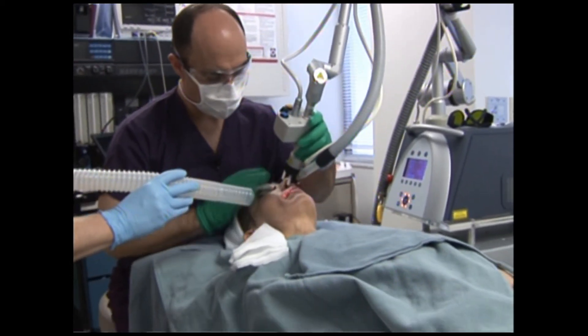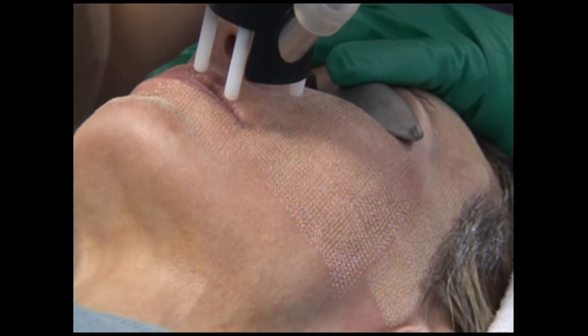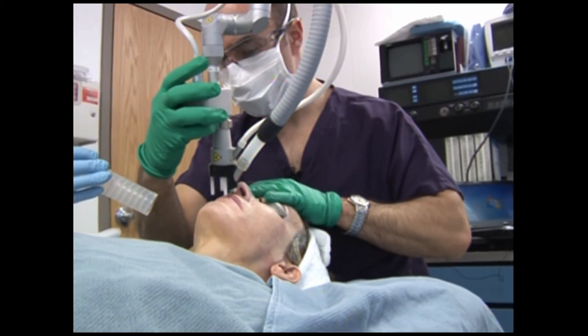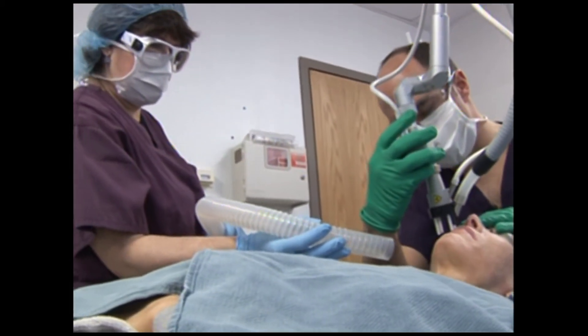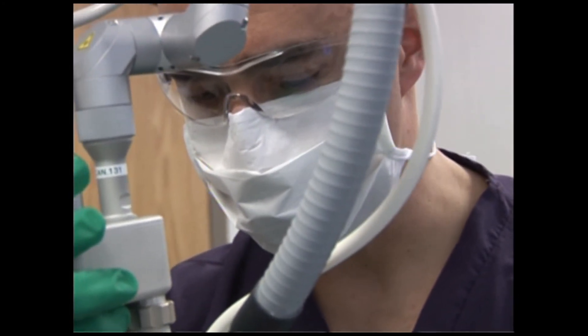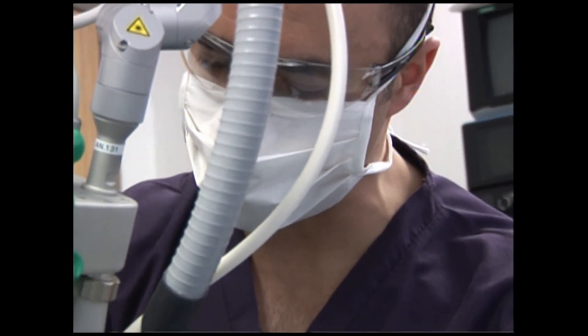It's really amazing how this laser lets me talk to somebody while I'm using a CO2 laser — I've never used a CO2 laser that let me do that. If you're getting acne scarring taken care of and there are some wrinkles, it's kind of a two-for-one: it's the same procedure. Christine, as far as the effects you felt from the laser, how would you describe them? The end result? I think it's great.